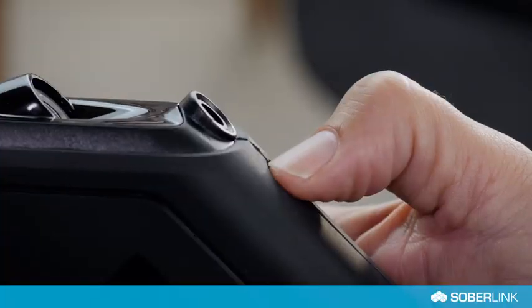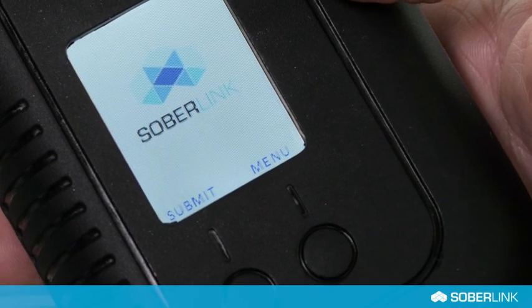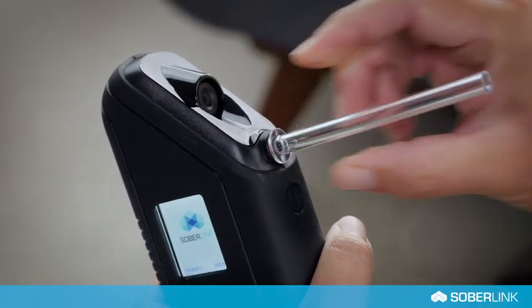Press the power button to turn on the device. The device screen will display the Soberlink home screen. Insert the small, flanged end of the Soberlink mouthpiece into the device.